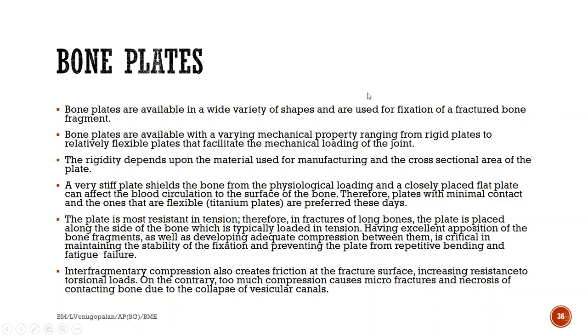Again, a plate is most resistant in tension. Therefore, in fracture of long bones, the plate is placed alongside the bone which is typically loaded in tension. So the side of the bone that endures the tension is where the bone plate will be fixated. Excellent apposition of the bone fragments as well as developing adequate compression between them is critical in maintaining the stability of the fixation and preventing the plate from repetitive bending and fatigue failure.